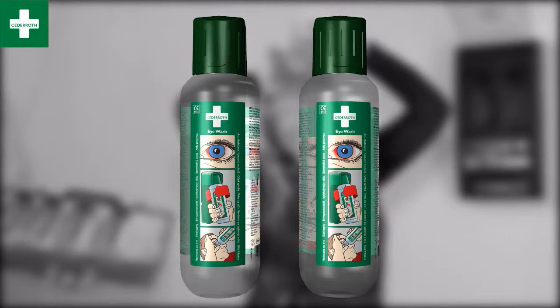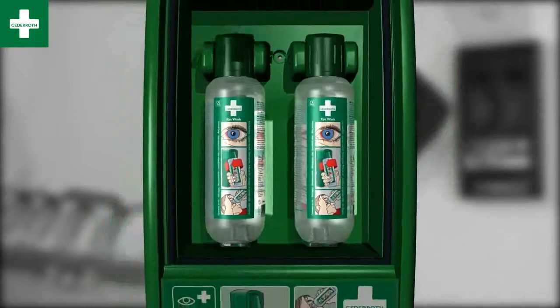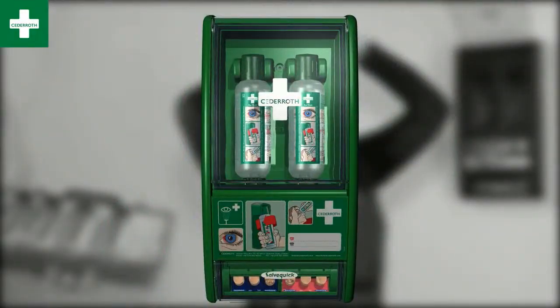Cedaroth's eye wash is delivered in large bottles and has a long shelf life. They're delivered in pairs, so you can be sure the station is always ready for use.